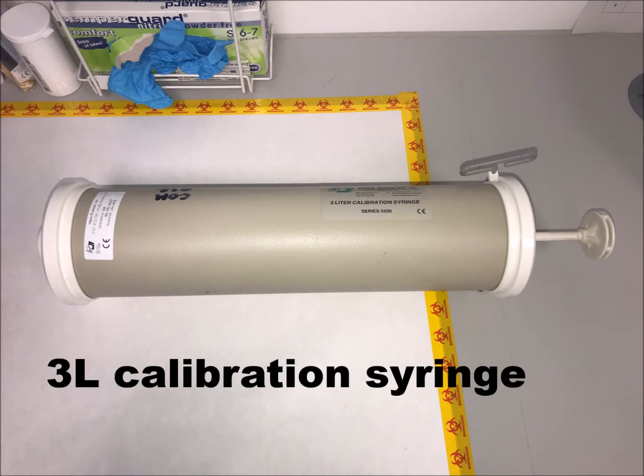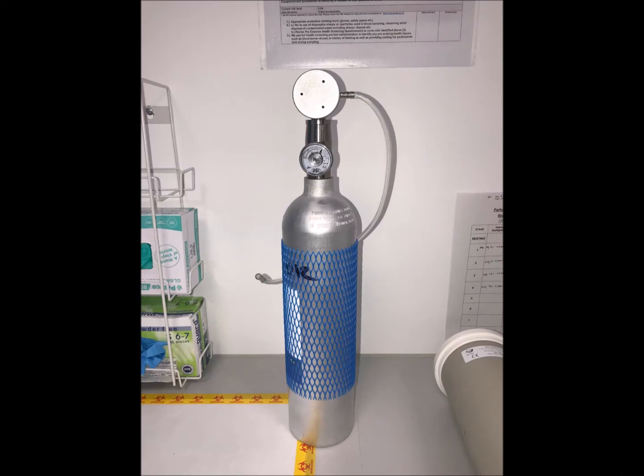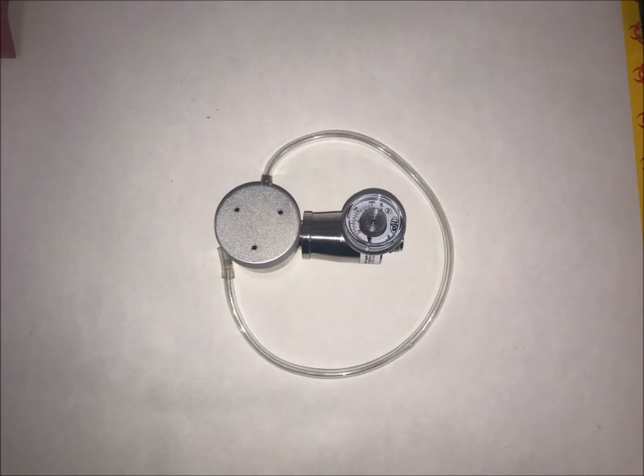For calibration, the following equipment is required: a 3-litre calibration syringe, certified calibration reference gas, a sample line which is linked to the volume transducer and should be connected to the Metalyzer, and lastly a pressure gauge.